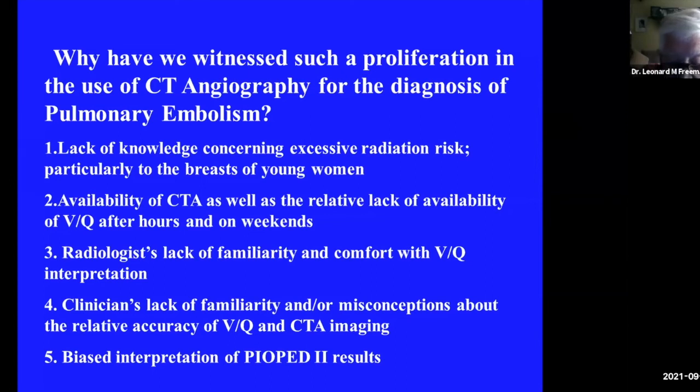And I'm going to add also now, particularly in view of the COVID epidemic that's been going on, people are doing less and less ventilation scans, because you don't want to put the technologist at risk or whatever. So you're either doing perfusion studies alone, which are good in many circumstances, I'm going to get into that in just a moment, or you're doing CTs.